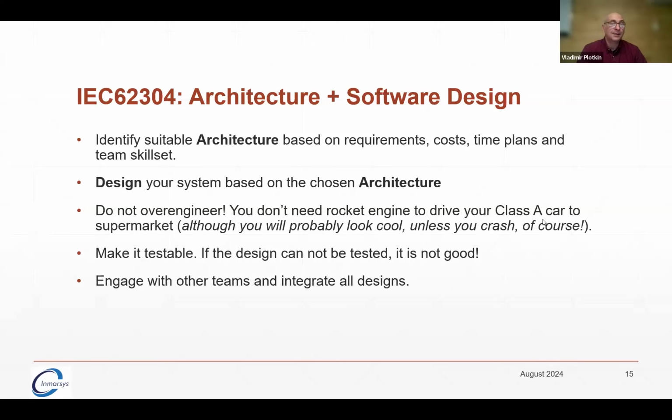So if you only have Python and they need to build an embedded device, then basically they'll have an issue. So we need to look at something more powerful, microcontroller and so on. So that's basically how you design your architecture. The important bit to remember is not to over-engineer, because most of the medical devices are designed to a cost. So you don't really need to put all the bells and whistles in the first release. Just design MVP, minimum viable product, and go to the market.